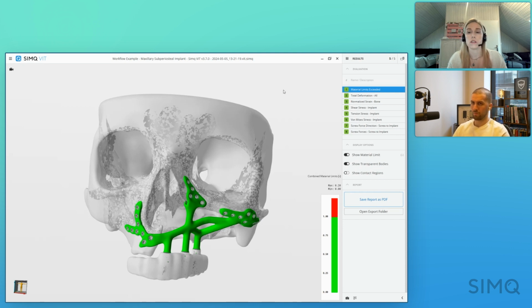And when you have some questions, I know, Jousef, you have the engineering background. I'm more on the medical side. So those two worlds come together with this software, which I think is really cool, because I'm more the end user, the clinical applier.